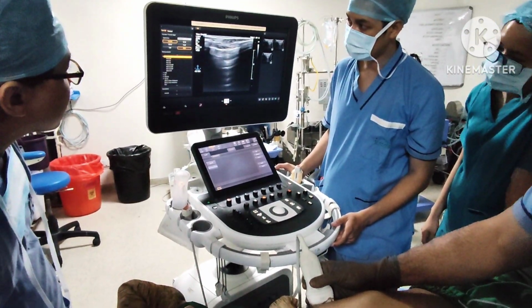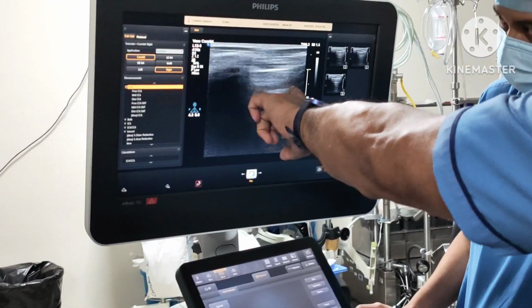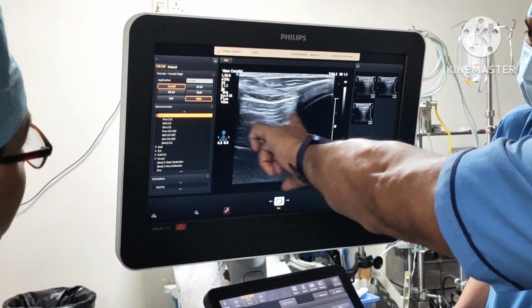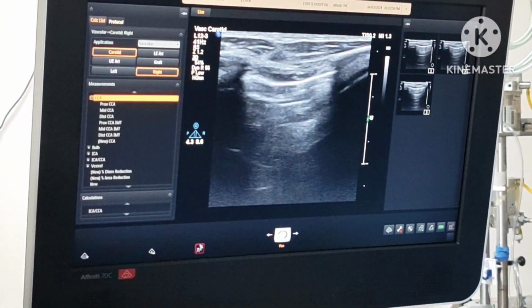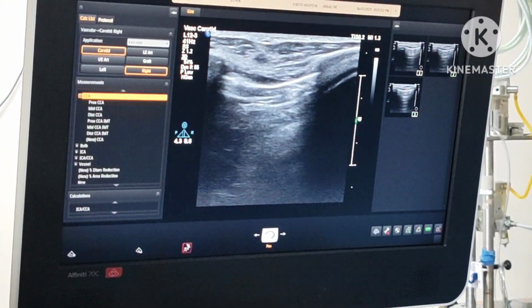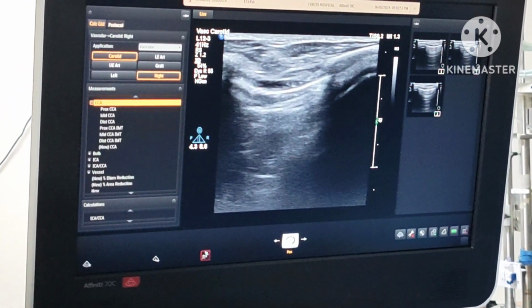The essential parts of the image: this is a rib over here, and there's a rib over there, and what you see below that is an acoustic shadow. It looks like a bat wing on both sides, right? In between, what is more important for you to see is to locate the lung sliding.